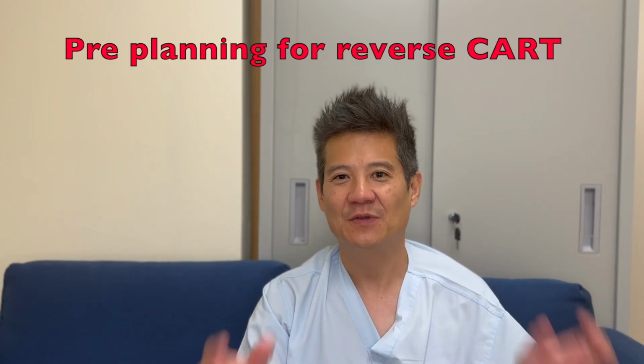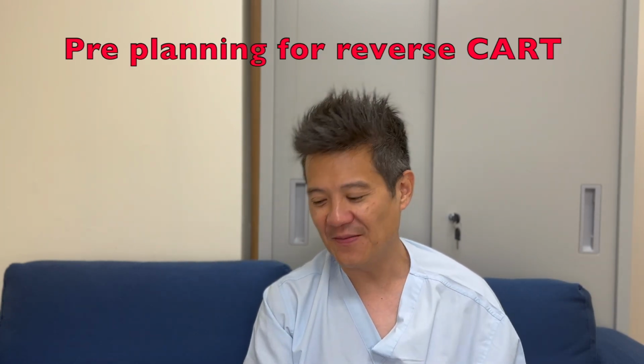And some of the talks previously will help. Balloon wiring will help. Understanding the IVUS and the arrangement and how to overcome each of the problems will help. Having done lots of IVUS-guided ReverseCART will help. But one other very important part is pre-planning the ReverseCART. And this is something that I've done for many years now.